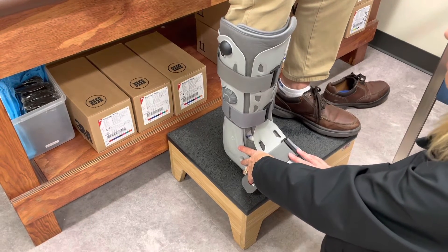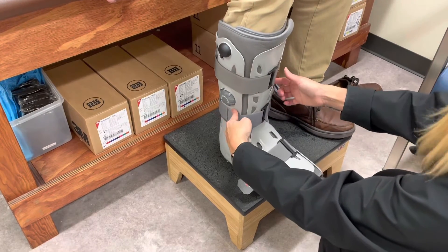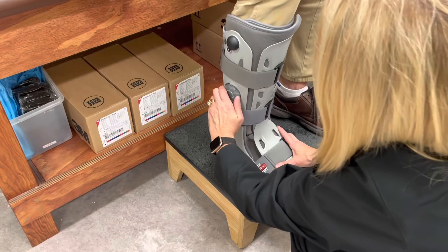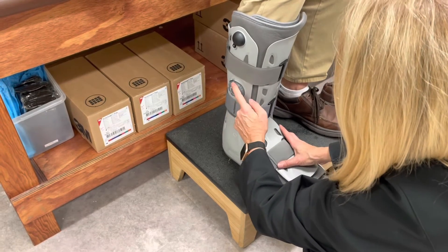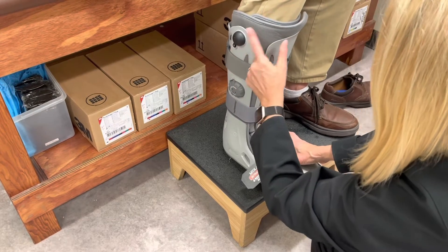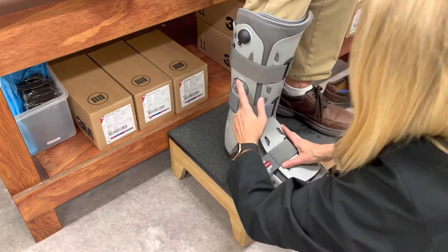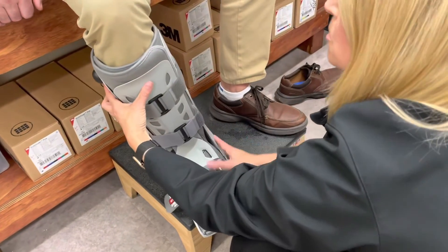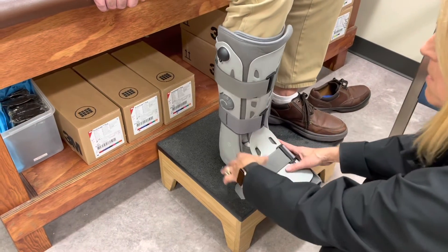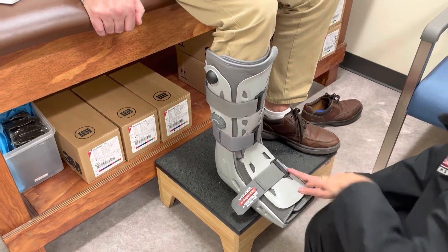I always tell the patient to leave it as is, unless the boot feels too tight. If it does, you can deflate the device: turn it to chamber one and push the deflate valve to release the air from chamber one. Then turn it to chamber two and deflate that valve as well. But it's not something they have to mess with on a regular basis.